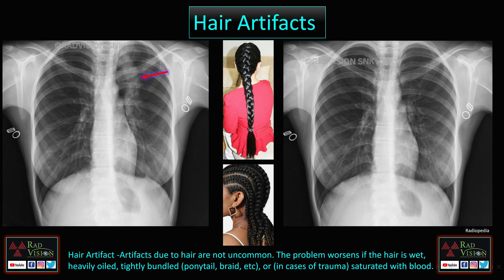Next case: here you can see a long elongated hair braid which mimics a lesion, but after removing the hair braid the lesion disappears — this is a pseudo lesion. Hair braids, ponytails, and hairstyles can mimic pseudo lesions. Artifacts from hair are more prominent when the hair is wet, heavily oiled, or tightly bundled, and in trauma cases where it is saturated with blood or foreign bodies.